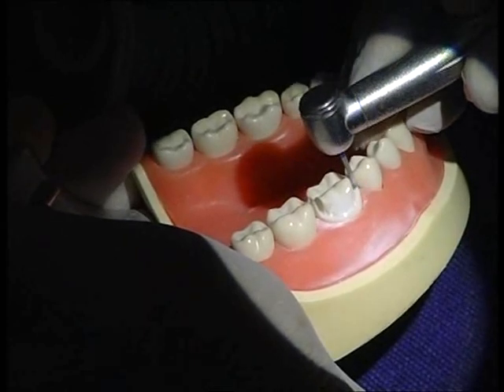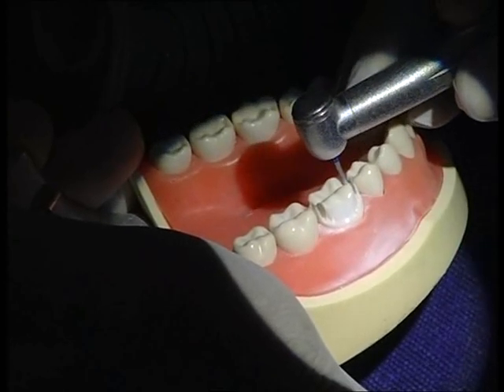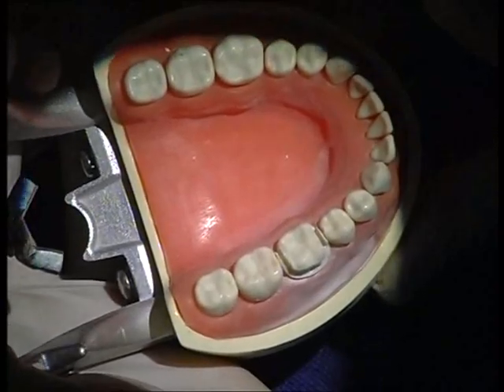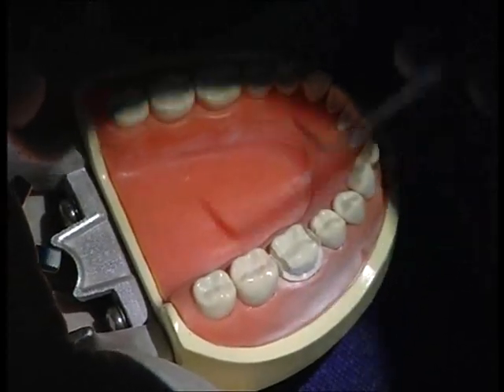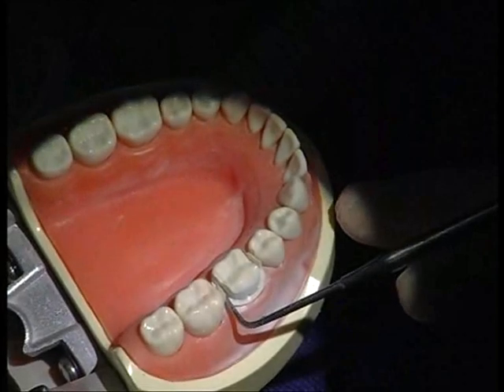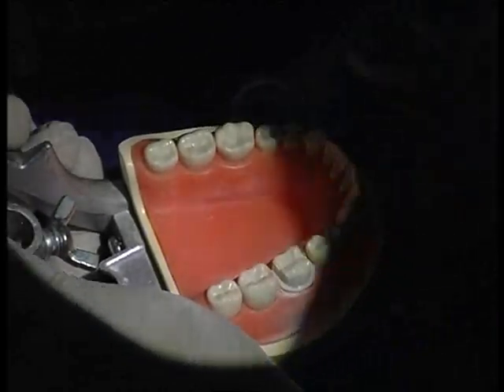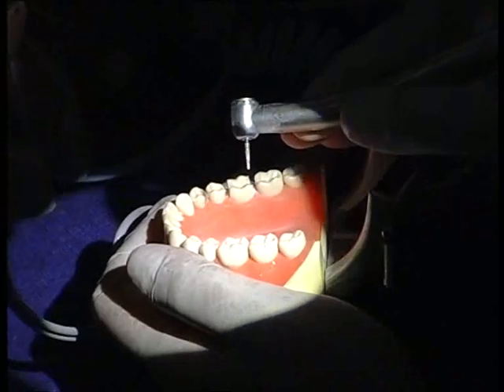Same thing here. Can you appreciate two wings present? You place it like this — can you appreciate how the probe is going in — and then simply do this movement. You place it inside and pry it; see how the enamel edge breaks off. Same thing here. At this point I have a choice of either decreasing the occlusal or going lingual. I personally always prefer to go lingual and decrease the occlusal last.